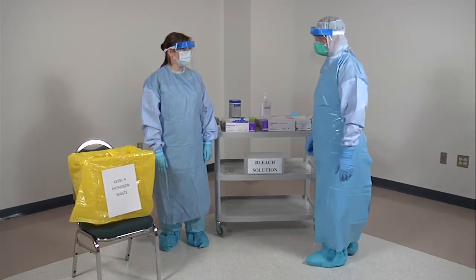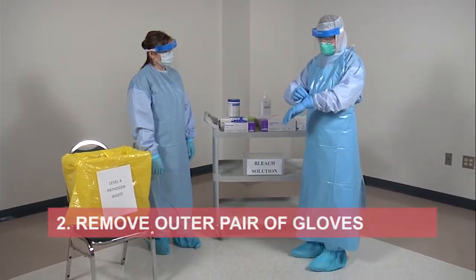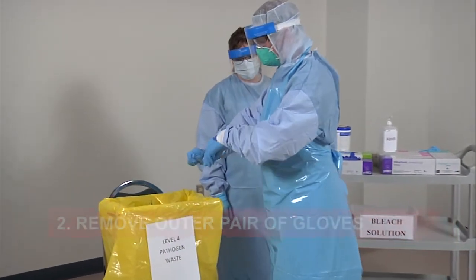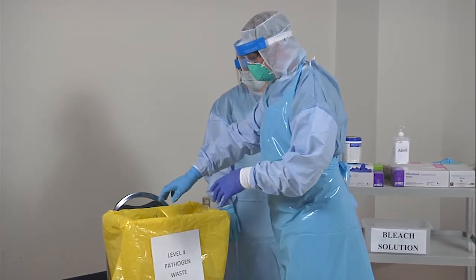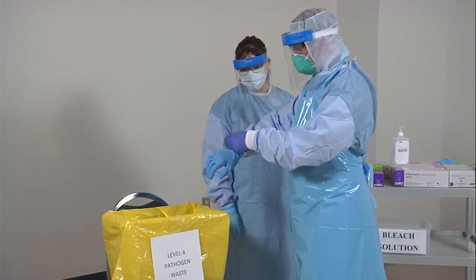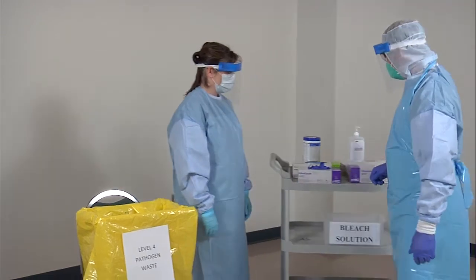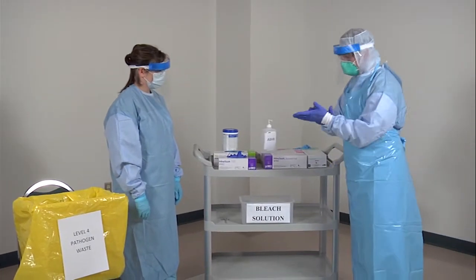Remove your outer pair of gloves. Grasp the outside edge of the glove near the wrist and peel away, rolling the glove inside out. Dispose of the glove. Slide one or two fingers under the wrist of the remaining glove and peel the glove off from inside. Discard immediately into the waste bin.